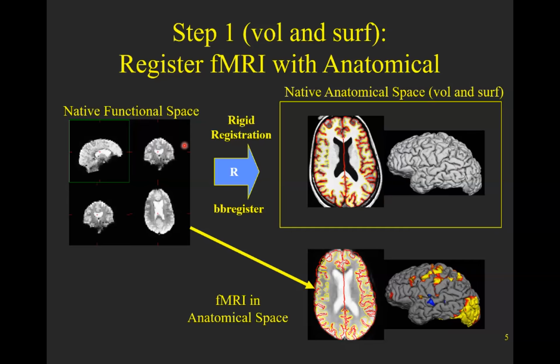And so you have your fMRI, which might be done in the same session. It might have been done in a different session. So people were talking about doing your anatomicals at 3T and your fMRI at 7T. Even when they're done in the same session, you can't count on the possibility that the person has kept their head in the exact same position, given that you need to register the anatomical and the functional to within a millimeter or half millimeter or something like that.